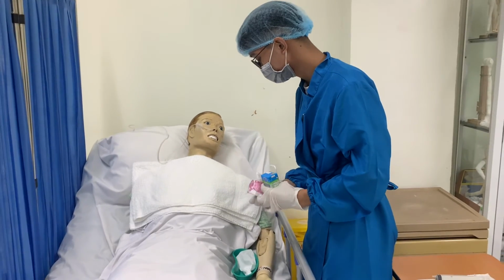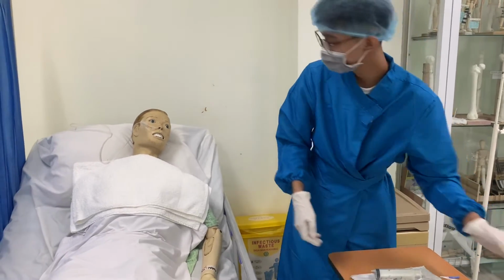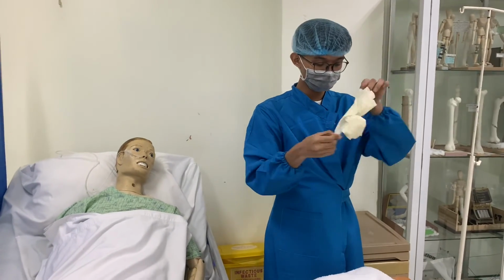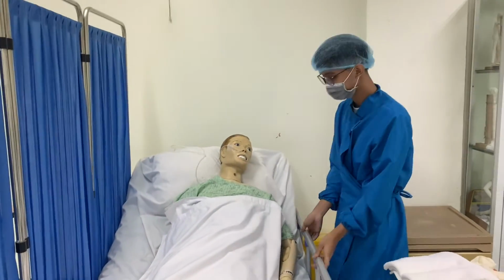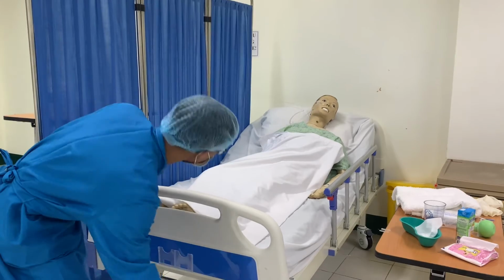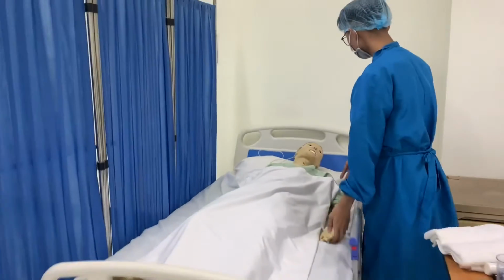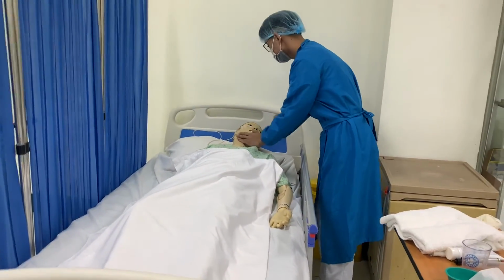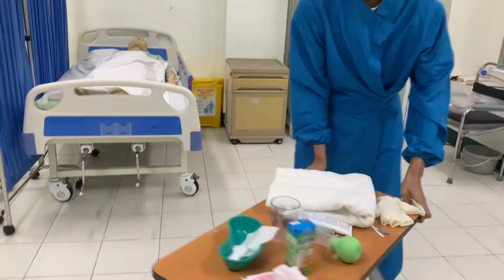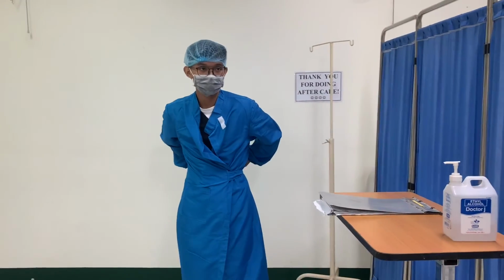Remove equipment and return the patient to a comfortable position. Remove gloves, raise side rails, and lower the bed. Remove additional PPE if used and perform hand hygiene.